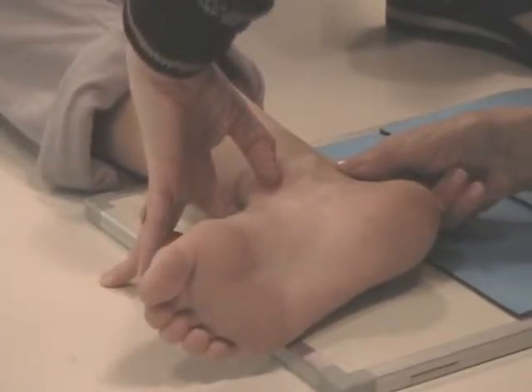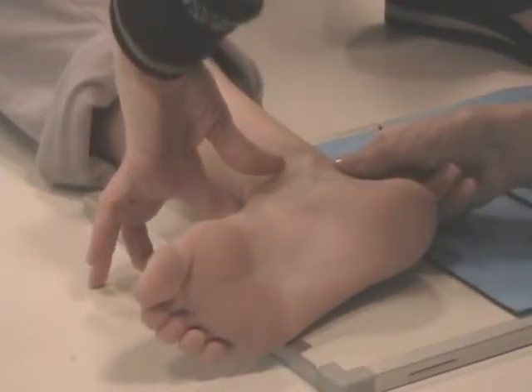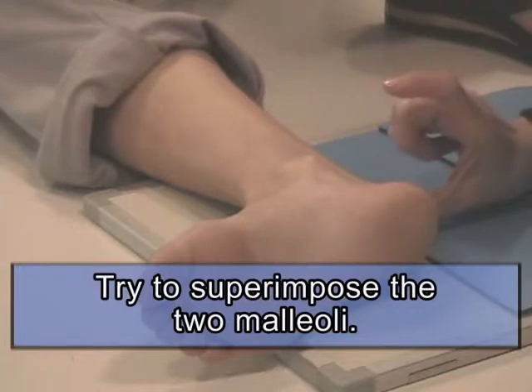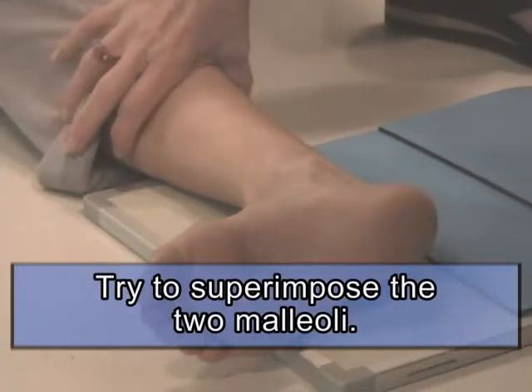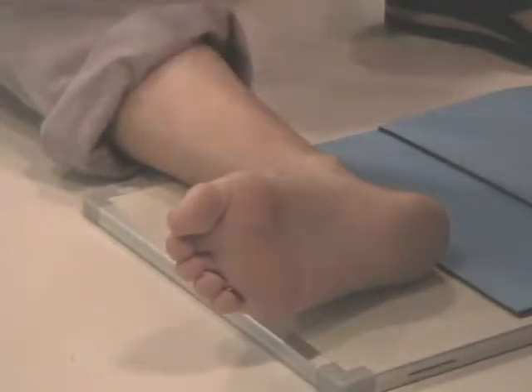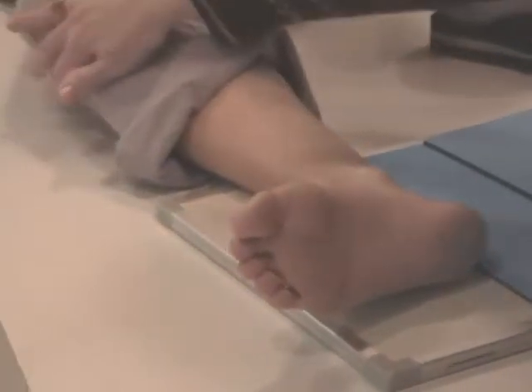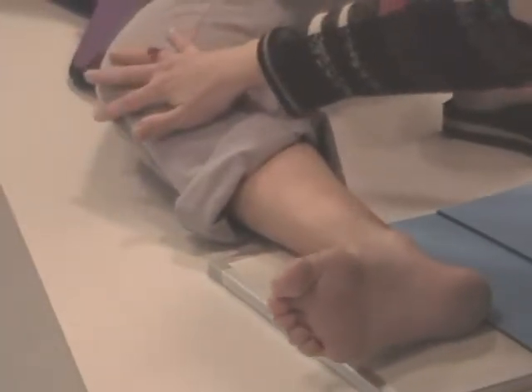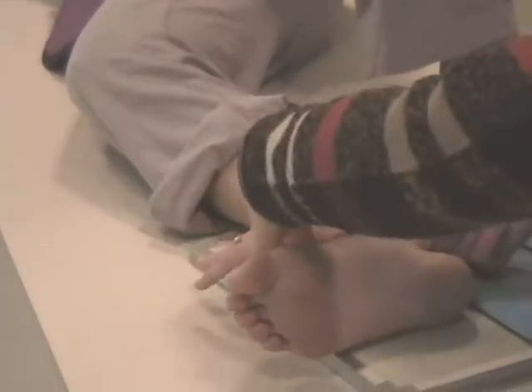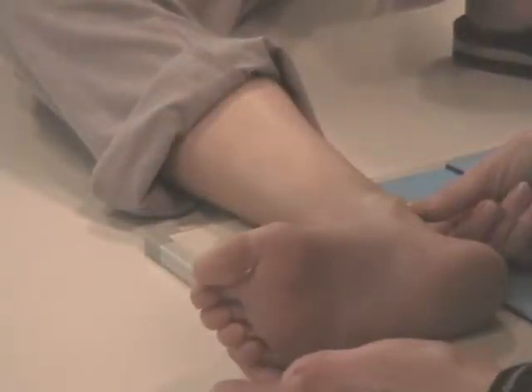You don't want to hurt this ankle, but I come in with my fingers very gently, and I'm trying to superimpose the two malleolar lines. And we're going to elevate her foot just a little bit by moving her knee. I do not handle the ankle, but I come for the knee, raise or lower that. And her malleoli are superimposed, one right on top of the other.